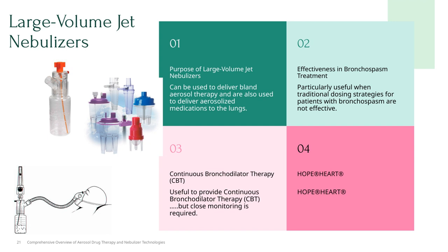They can deliver larger volumes of medication or humidification, which can make a significant difference in managing more severe or resistant airway constriction. So, in summary, large-volume jet nebulizers are essential tools. They're adaptable for both bland and medicated aerosol therapy and are especially valuable when patients need more aggressive or continuous treatment. Their role in effective respiratory management cannot be overstated.